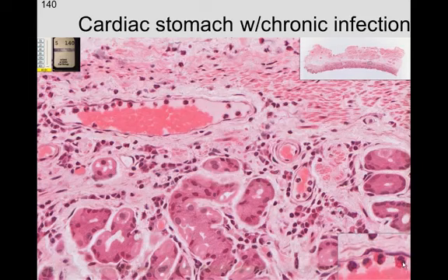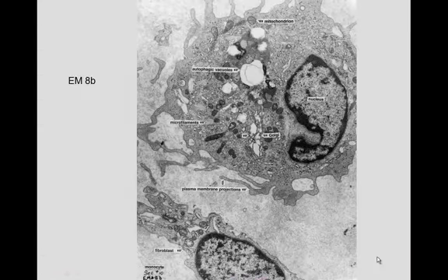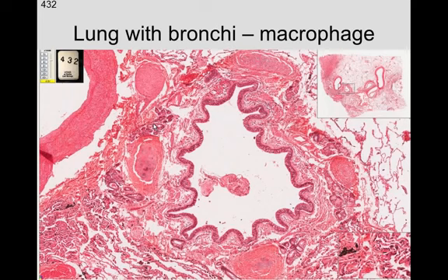Here you can see these probably neutrophils, even though it looks like eosinophilic granules, they're probably neutrophils going out through there. We see a monocyte in through there, a lot of cytoplasm, euchromatic nucleus, projections off that would be associated with development of a macrophage from the monocyte.